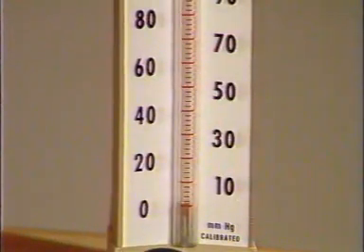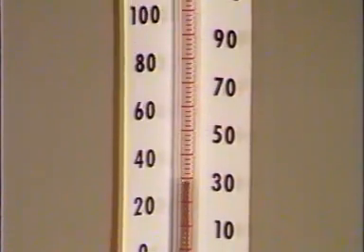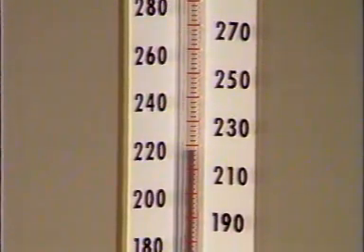The pressure is then raised by inflating the bladder to 30 mmHg above the systolic blood pressure, as estimated by palpation. Next, the pressure is reduced at 2 to 3 mmHg per second.